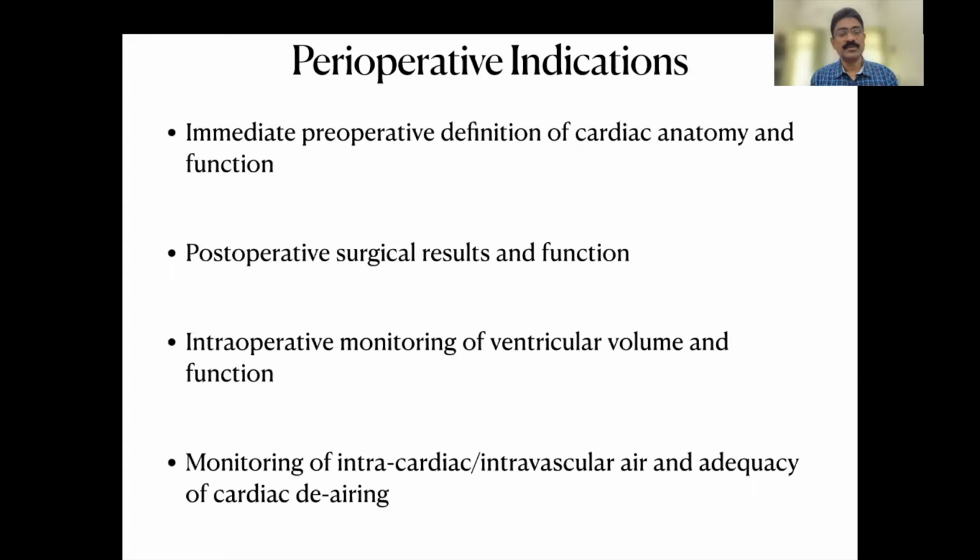The second most important indication is the postoperative assessment of surgical results and function by transesophageal echocardiography. It also helps anesthesiologists in intraoperative monitoring of ventricular volume and function. And whenever it is available, please use it for assessing the adequacy of cardiac de-airing.